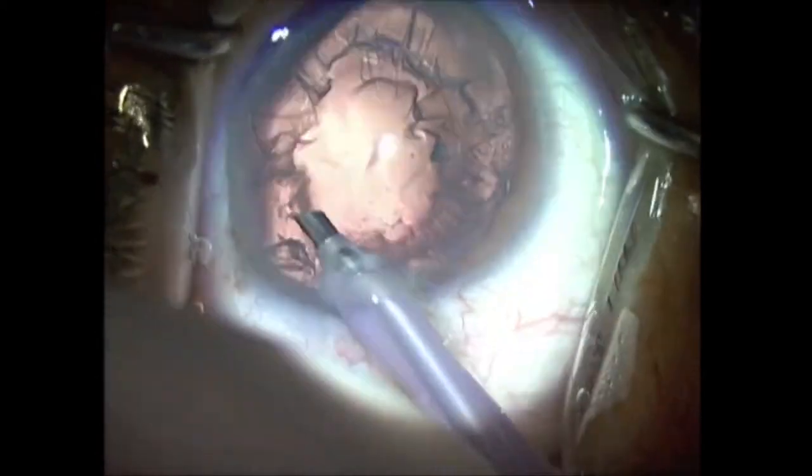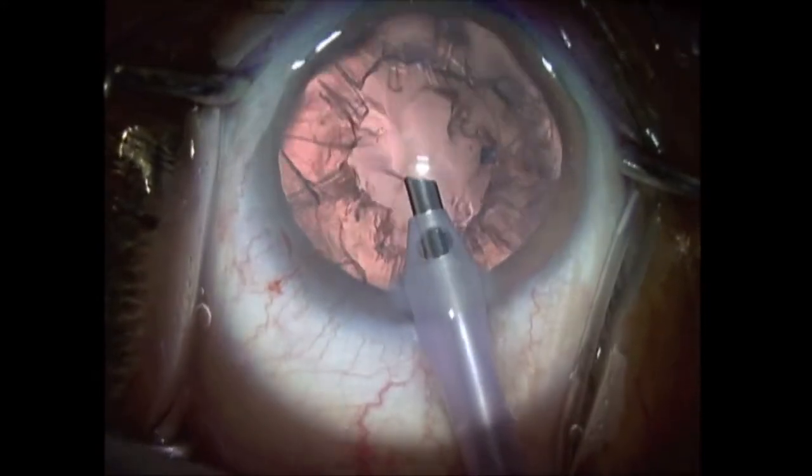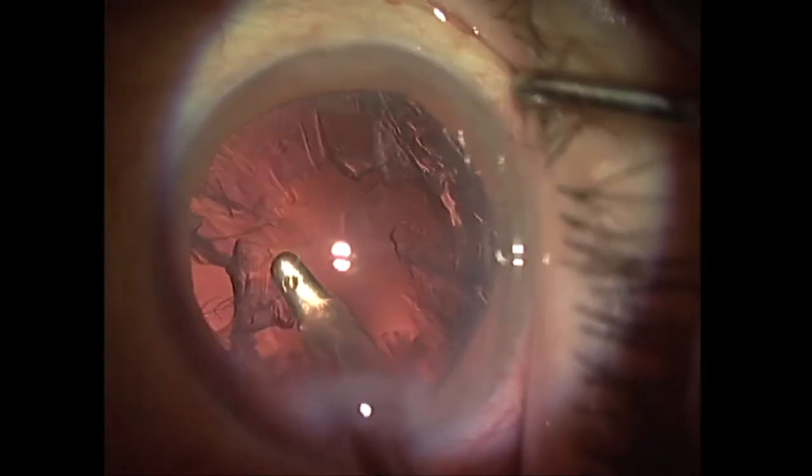Nevertheless, at the end of the nucleus emulsification, aspiration of the remaining cortical fragments is still an important step to be performed. Many surgeons perform cortical aspiration moving the irrigation aspiration handpiece from the periphery to the central area of the eye, a movement that is denominated radial aspiration.